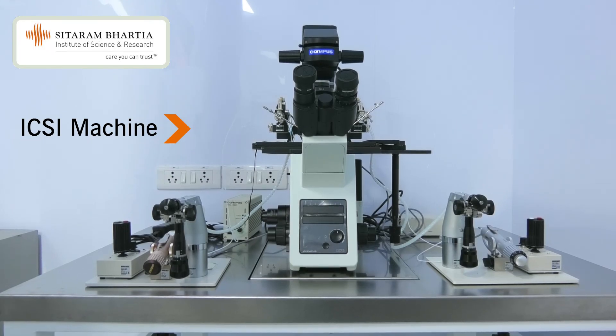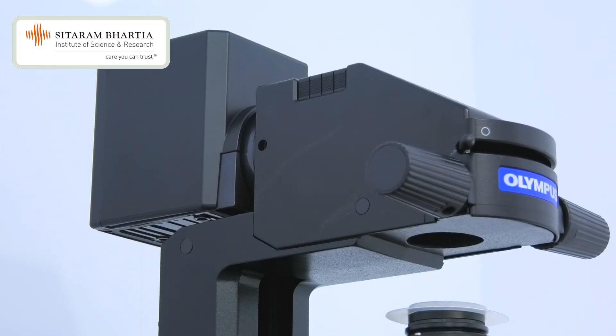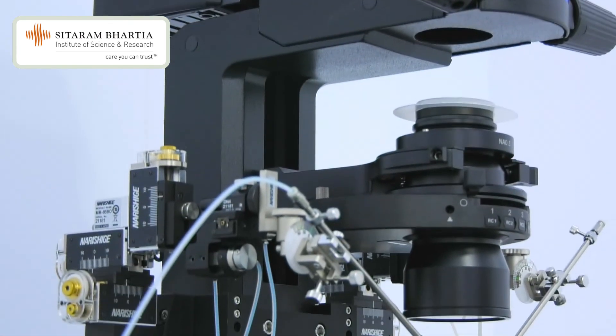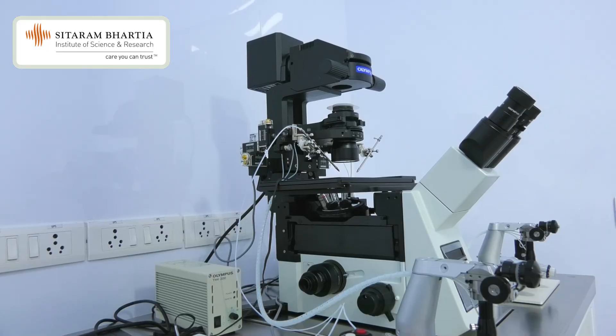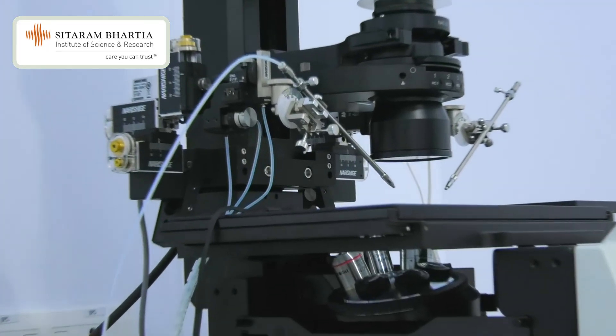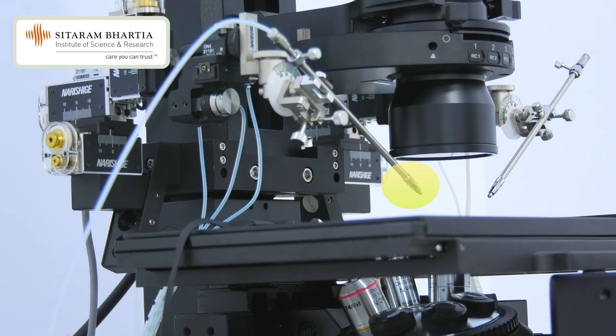This is the ICSI machine. With this machine, we perform ICSI, which is intracytoplasmic sperm injection. We do the micromanipulation of all the gametes with this part, and here we have the holding and injecting needles.